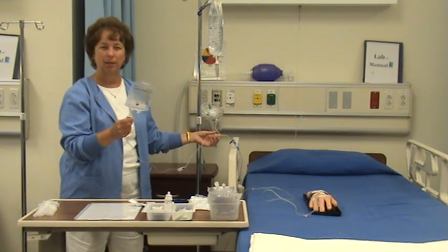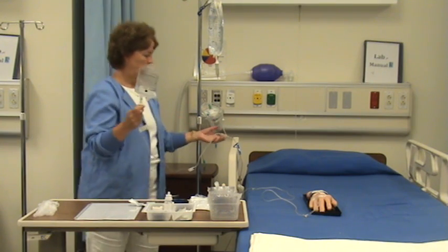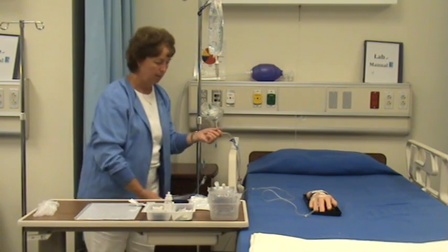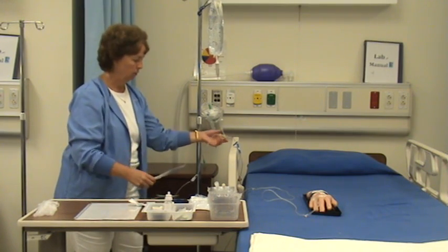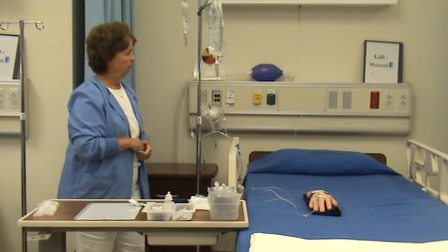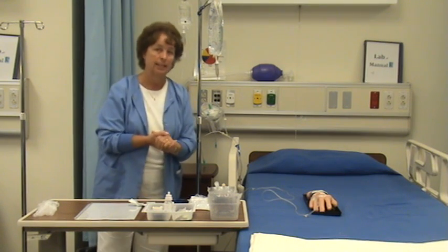Not another method, but another alternative to that is also back priming. The only thing is, if you have an empty tube, you plug it in with your antibiotic at the end and you back prime it this way. Rather than holding it up and priming it, you can hook it up and prime it this way. Okay, that's it for IV piggyback through an existing IV line.